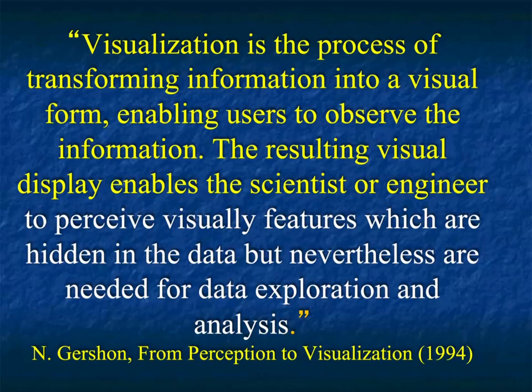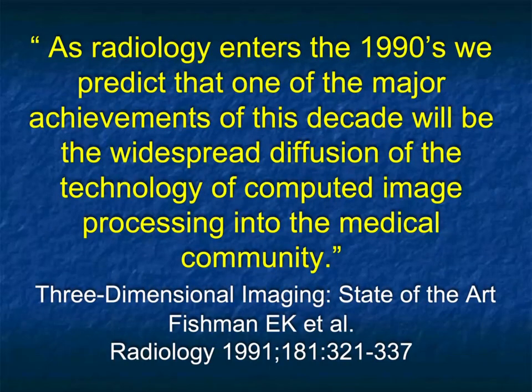Now, lots of articles in the beginning. This was a good article by Gershon, and he was at MITRE. Visualization is the process of transforming information into a visual form, enabling users to observe the information. The resulting visual display enables the scientist or engineer to perceive visually features which are hidden in the data, but nevertheless are needed for data exploration and analysis. And perhaps in my mind, this article was so important because it took you away from the term 3D, whatever 3D meant, into more visualization. So everything we've spent our time doing ever since then is really visualization. Can we understand the data sets better?